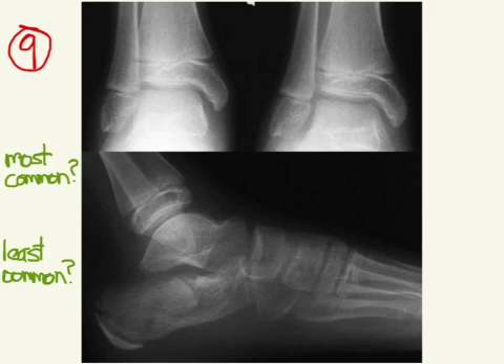This one again is a little bit difficult to see, but you can see here we have a nice epiphyseal plate there. All of a sudden in the middle it kind of gets jammed up over there — or rammed or crushed. So we'll call this a Salter-Harris 5.